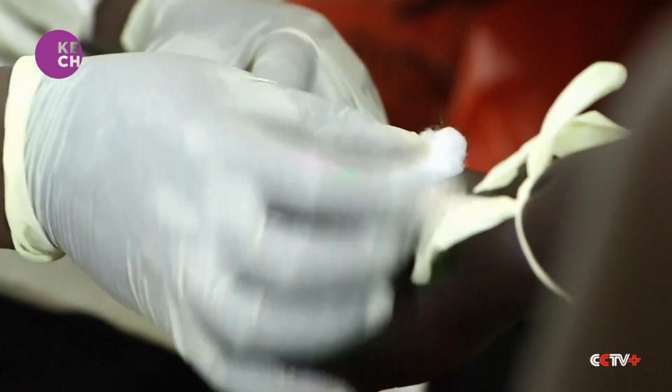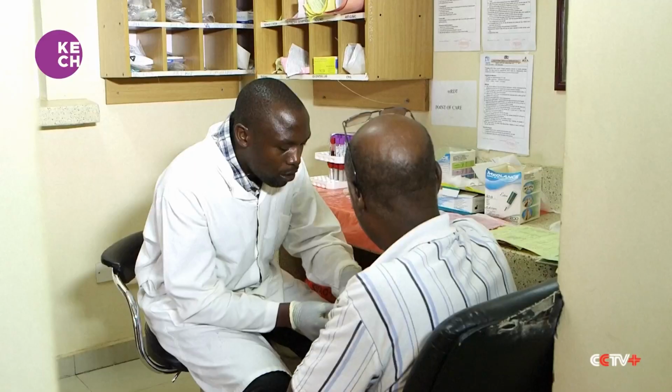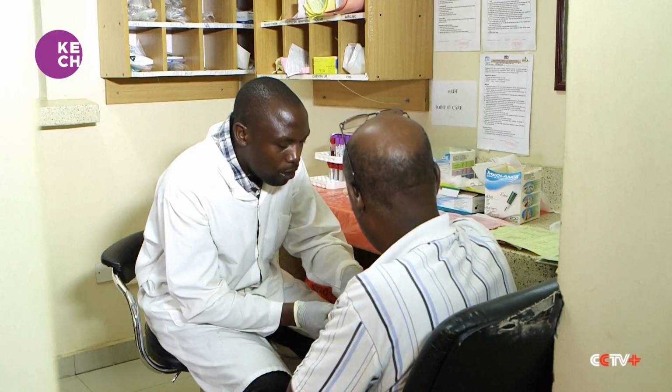So the kit works on the principles of light scattering. So you can be able to tell the components of your blood by just shining light onto it. So that is the working principle of the kit, and that's where the technology is built on, of course, to see that we can be able to scan that and be able to return results on the status of your conditions. Gita says this method is quicker than blood testing and does not cause trauma among patients who fear needles.